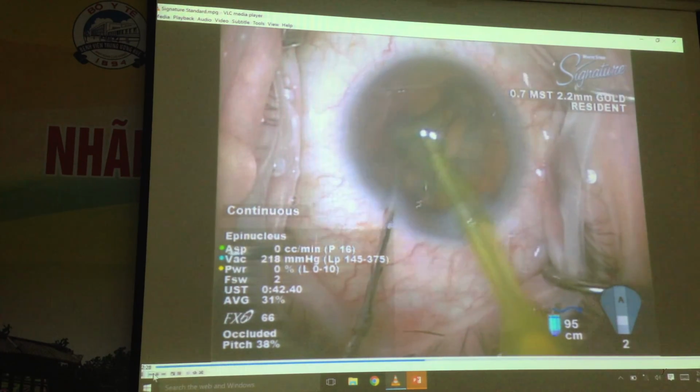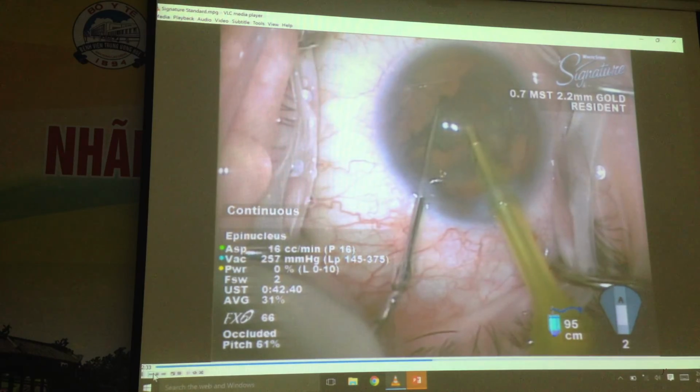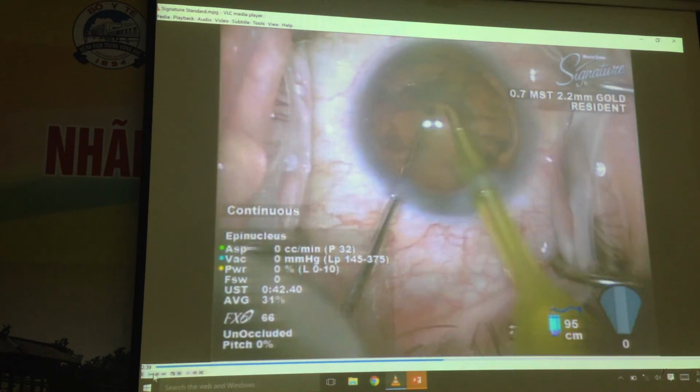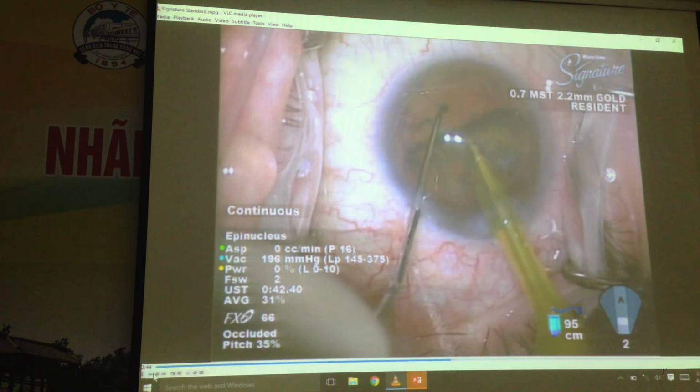and having it trimmed so that it then flips, all with control, with no phaco power at all, using the principles of followability, distal and proximal followability.